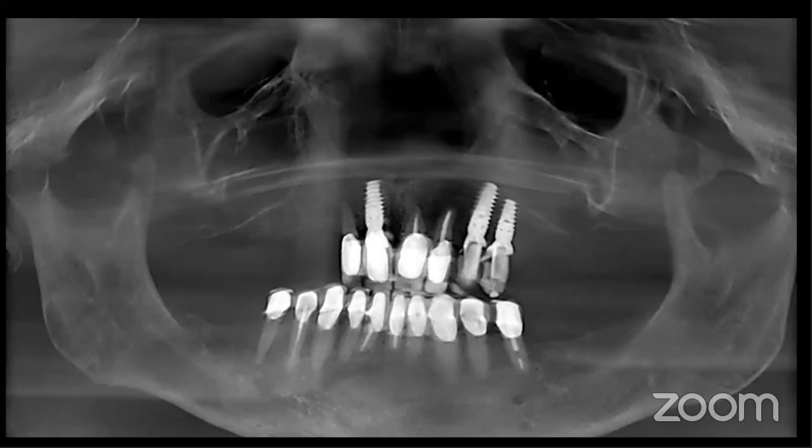And so we gave this patient the option of zygomatic implants. And because of his age, he declined to have them. And so we had to come up with an alternative. So for this particular patient, we look at where his sinuses are. And they've pneumatized because he's been missing his posterior dentition over time.